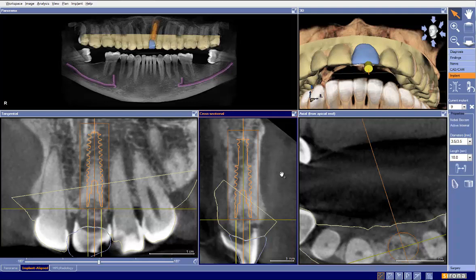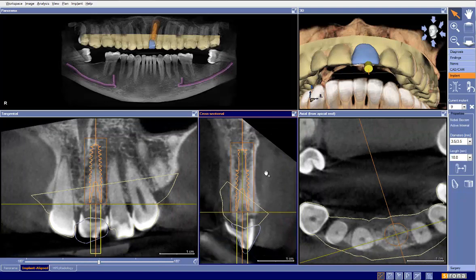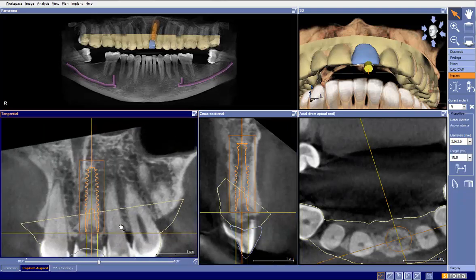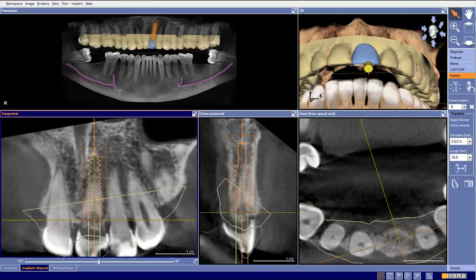The other thing I could do is it offers me a longer implant. So now I can go 18mm, and suddenly stability is not that big of an issue. Technically, I could probably even consider doing something like this. This is a bit more risky, maybe not for the faint of heart, but certainly now suddenly I'm a little more comfortable going into immediate placement with this particular implant now.